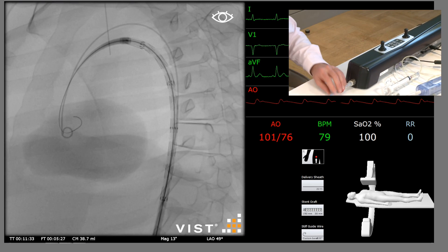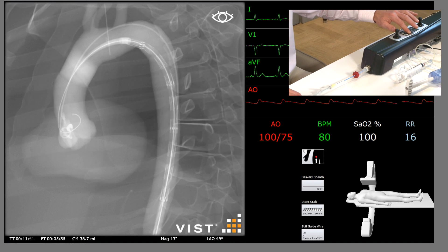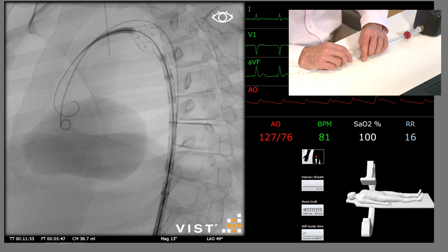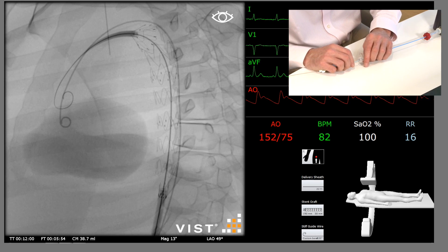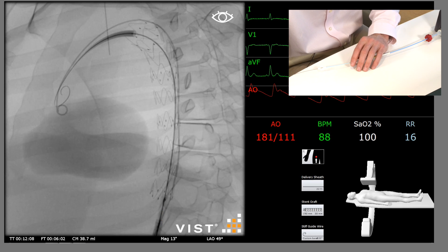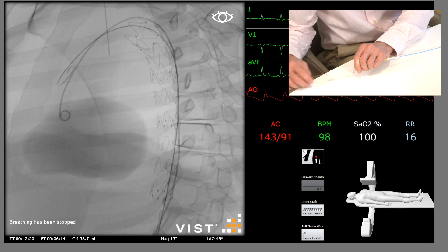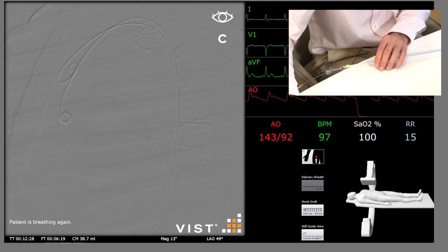We're going to fade out briefly and advance the stent graft a little more, then fade in and confirm positioning. We're well away from the subclavian artery, we're above the celiac artery, and we're across the ruptured segment. We're going to gradually uncover the stent graft — you can see it has a bare proximal stent with a constrained tip. We fully uncover the stent graft and then deploy and release the tip, which is designed to stop windsocking. We then remove the stent graft delivery system. We now need to repeat the angiogram and confirm positioning, and also confirm exclusion of the aneurysm.